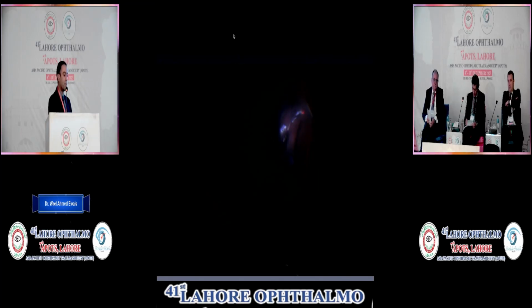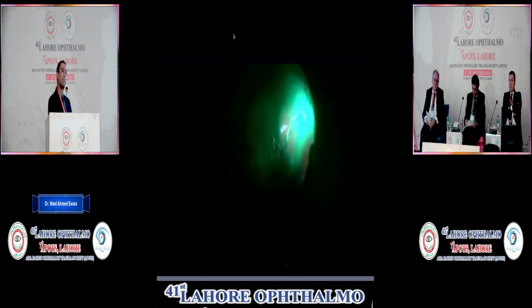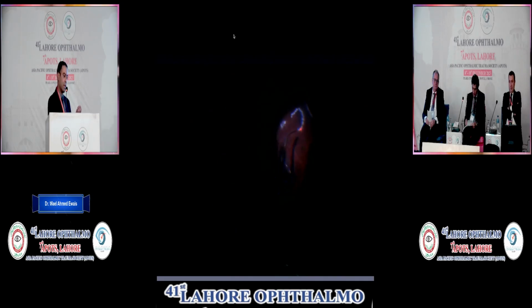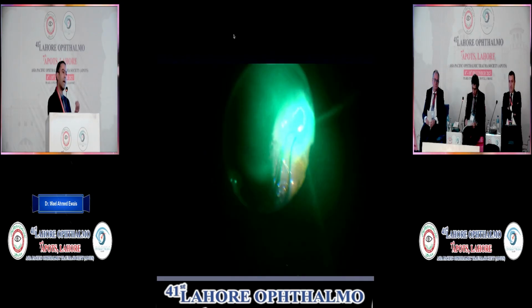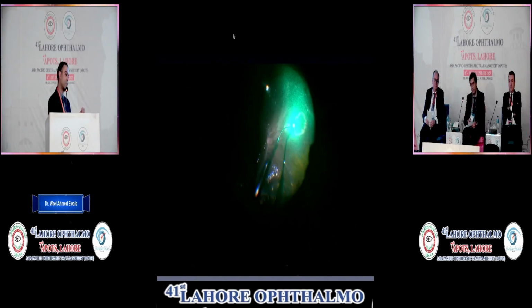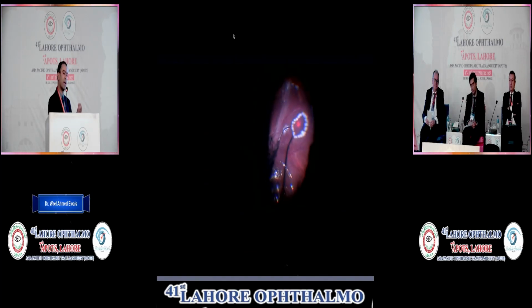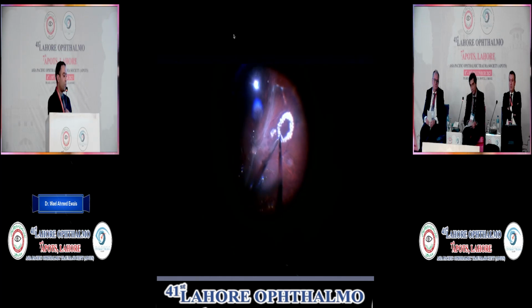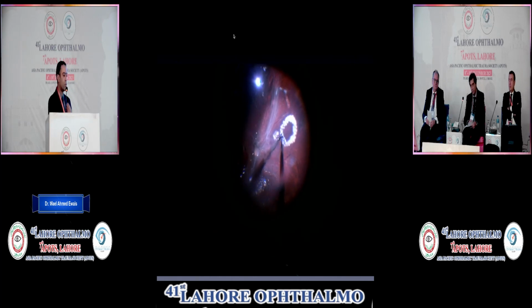After that came the main problem. I think a large macular hole like this, which looks like it is an iatrogenic hole related to the vitrectomy that was done, or a traction later on. My only option, as I think, was to do an autologous retinal transplantation.